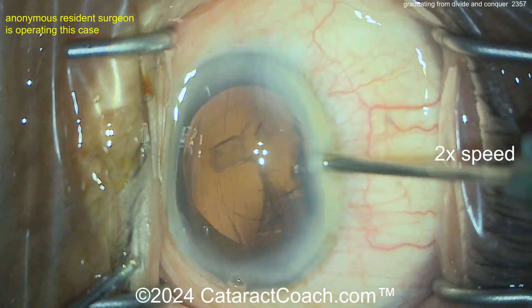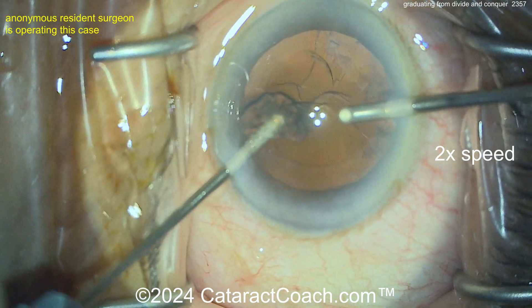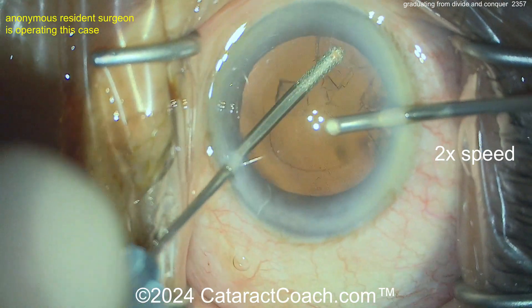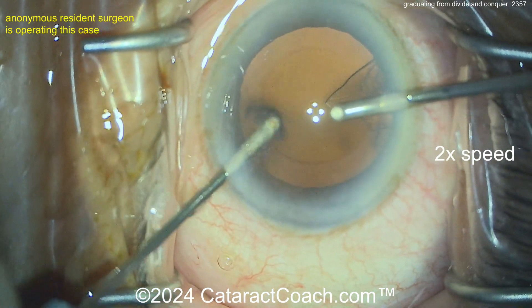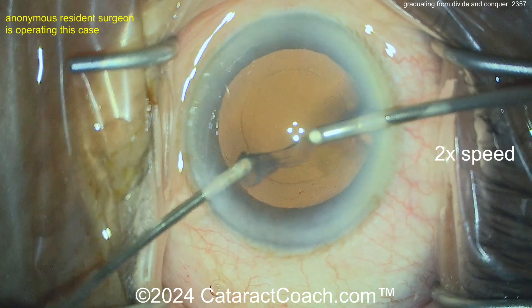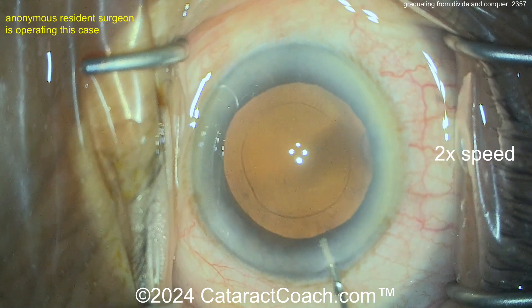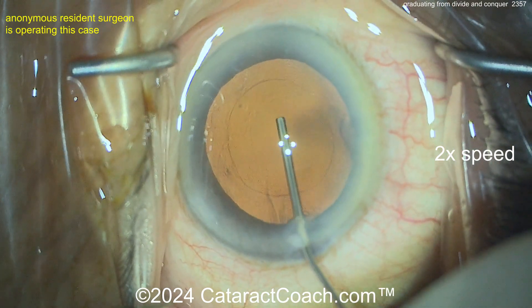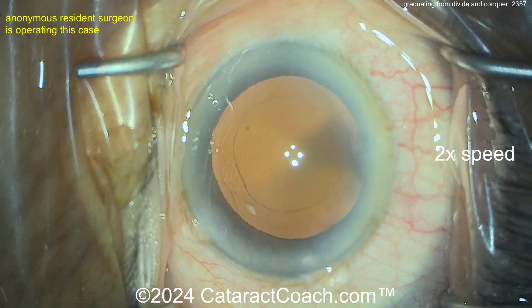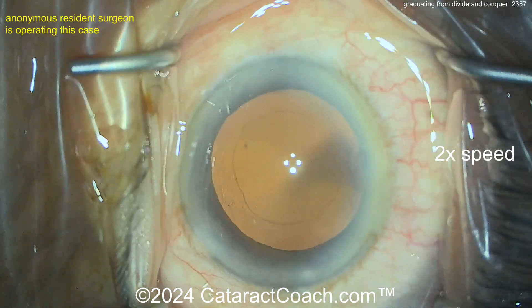I liked your divide-and-conquer slash stop-and-chop technique, but I think you can just go to straight stop-and-chop. You don't need that extra groove — just split it in half. I have a video showing how after you crack it in two halves, you can use the chopper to pull one half away, create a gap, then use the phaco probe with vacuum to bring the other half up.